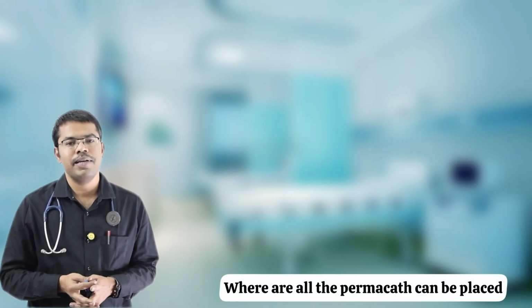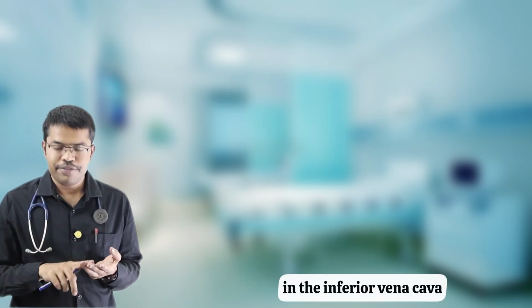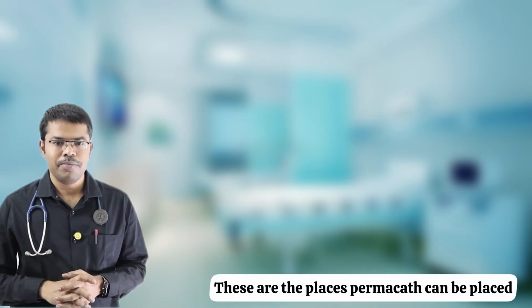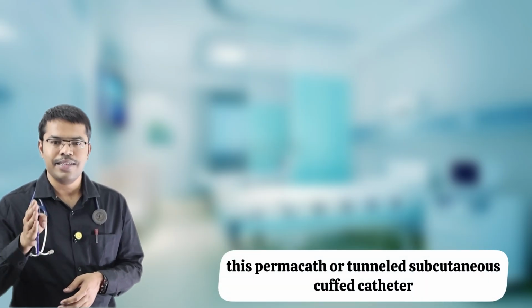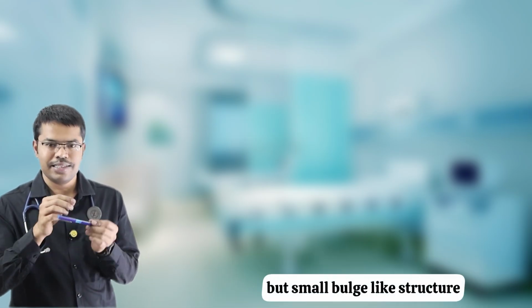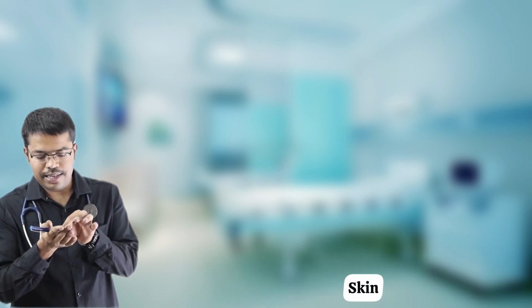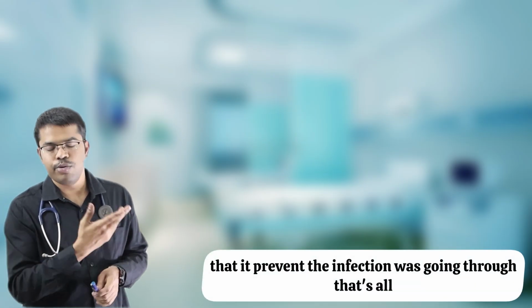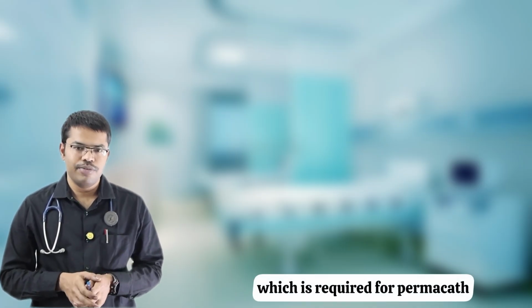Where can the Permacath be placed? Internal jugular vein, right side and left side, femoral, in the inferior vena cava, very rarely subclavian vein. These are the places a Permacath can be placed. Most commonly, this Permacath or tunneled subcutaneous cuffed catheter. The cuff is nothing but a small bulge-like structure which forms adherence with the skin subcutaneous plane, then it prevents the infection from going through. That's all. This is the info which is required for Permacath.